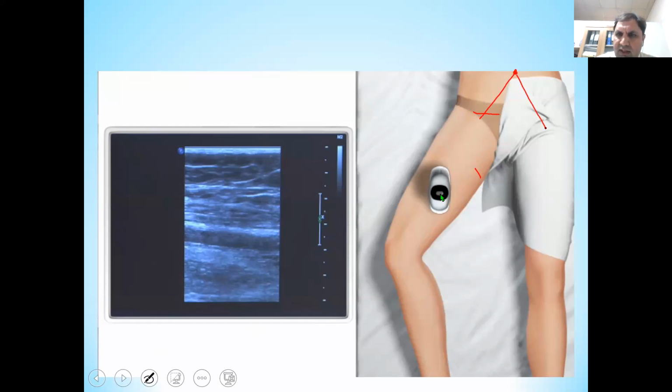While passing under the inguinal ligament, it becomes the common femoral artery, with the adjacent common femoral vein. The common femoral artery will soon bifurcate into the femoral artery and the profunda femoral artery. The profunda femoral artery will have multiple branches supplying the local muscles and other organs and systems.